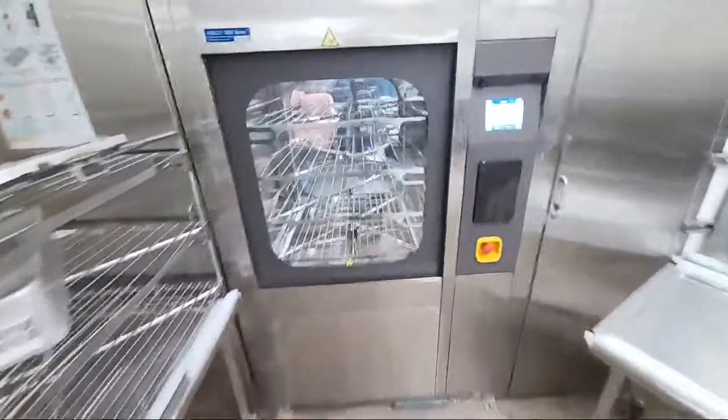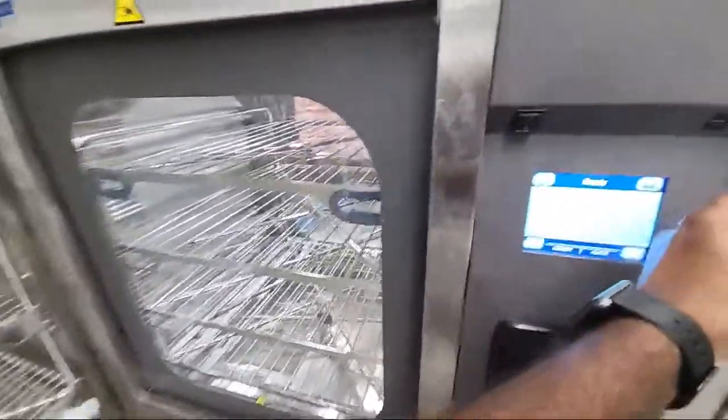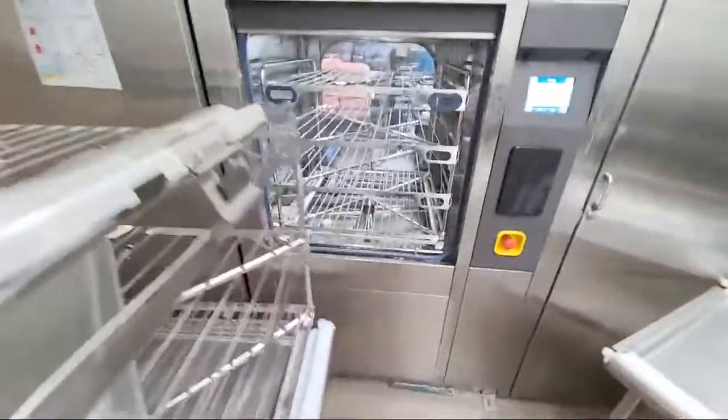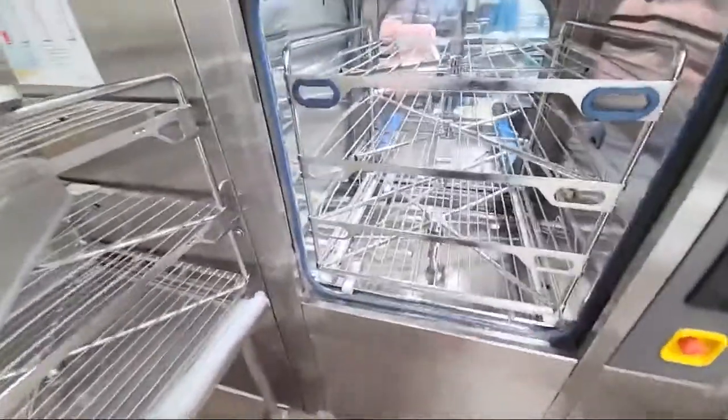Here is the washer disinfector. So on this side, we open it, and here I'll tap it. I'll wash my hands on the other side. So here we open it, and then we pull this cart on in this way. No, there's already a cart in there. So this is how we carry the cart. We put it on there. We load it on.